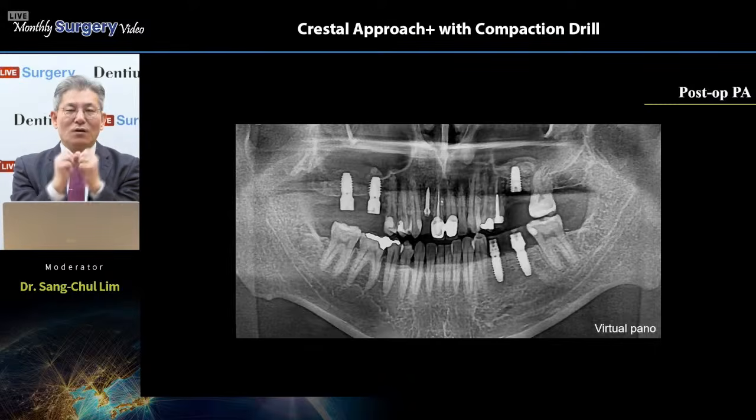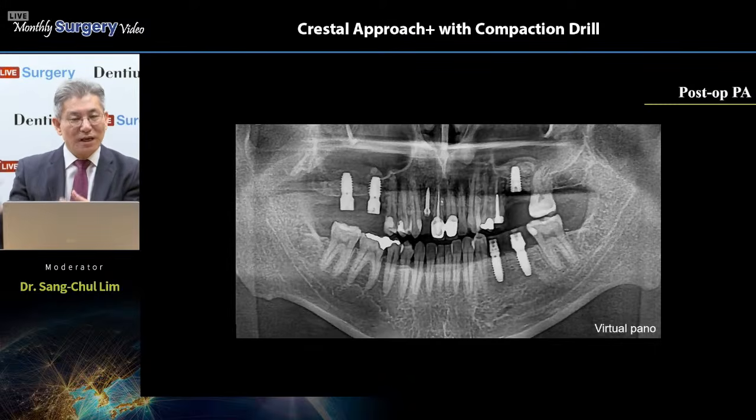As you know, the bone making cell source comes from the floor and sinus membrane. So widespread means better, and many bone cells come from this area. So faster bone formation and the bone quality will be good.